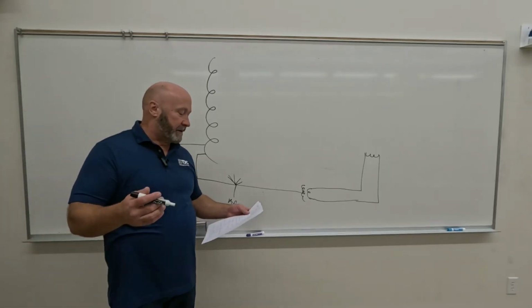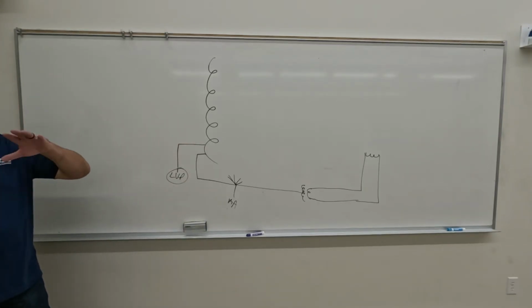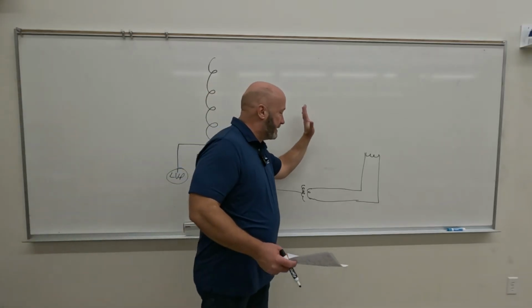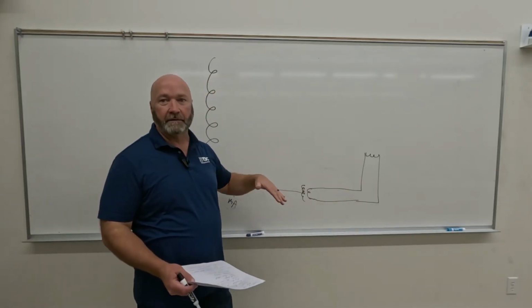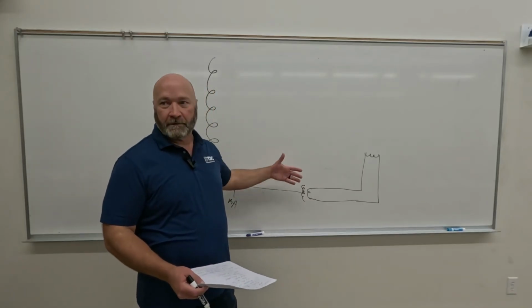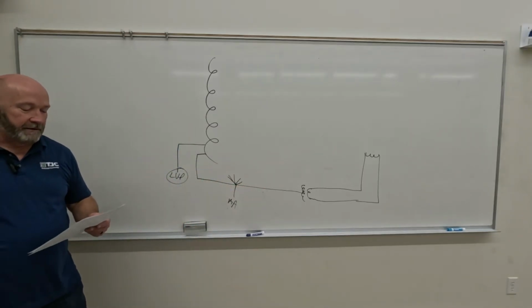The things that we talked about on that were the entire mA circuit. On the test, in the textbook, if you look at the diagram at the end of the chapter, it has the high voltage circuit going through the filament circuit. On the test, I'm going to call this the filament circuit, just so that we don't confuse high voltage with the low voltage filament, which is very low voltage. So this is our filament circuit. It's the mA circuit, the filament circuit.